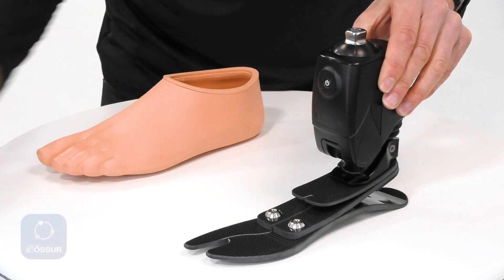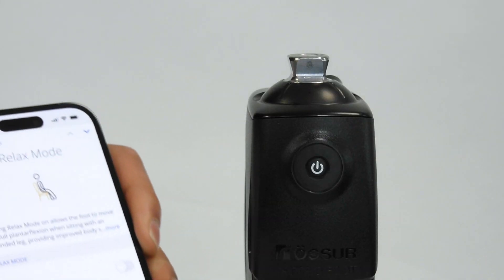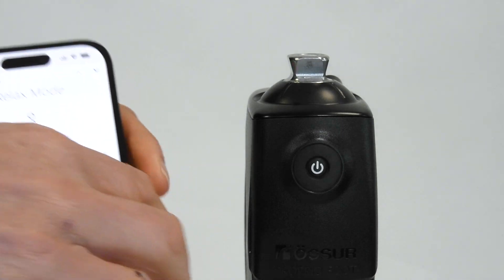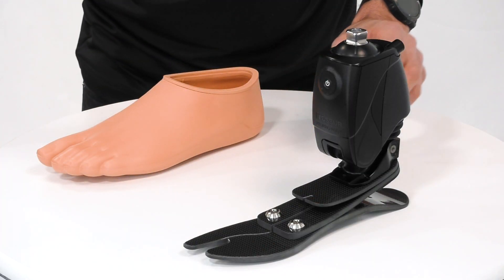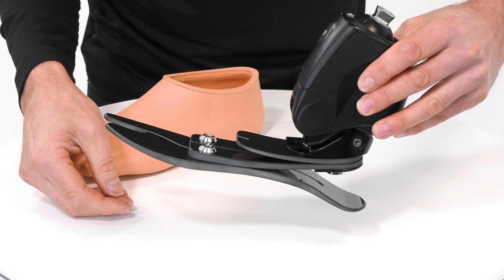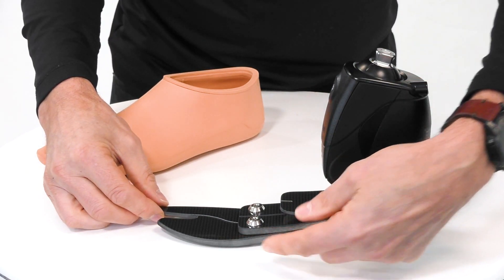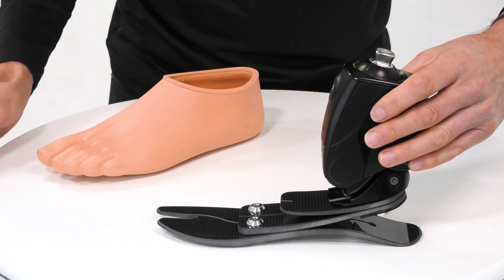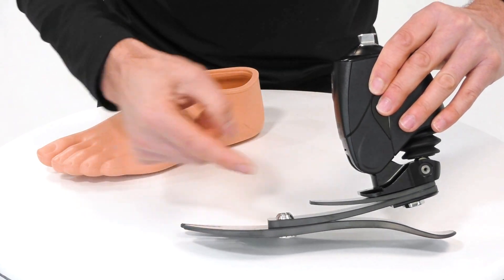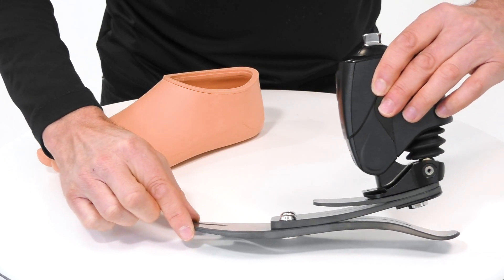By going into our Ossur Logic app, we're able to engage other facilities of the foot. By pressing this, for example, we can initiate relax mode, so that when a user is sat down in a chair the foot will go into a state of plantar flexion, giving a more cosmetic but much more comfortable feeling during sitting. There's also a feature called chair exit, so that when the user rises, the foot goes into a state of dorsiflexion, making it easier for the user to get their foot under the chair and rise from that position.